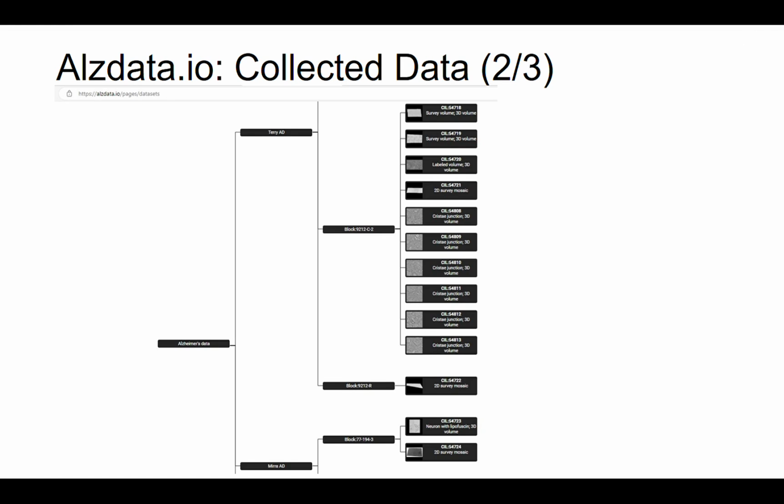In the Hierarchy Viewer, the first level of the tree branches represents the neuropathologist's name, serving as an index for a specific biopsy sample collected or provided by that particular neuropathologist. The legacy samples in our database come from renowned neuropathologists, doctors Robert Terry and Suzanne Mirra, who collected them in the 1960s and 1980s, respectively. These historical samples serve as a critical foundation for current research into Alzheimer's disease.